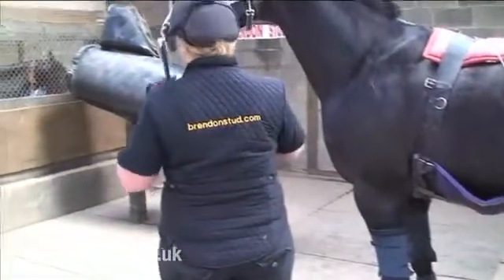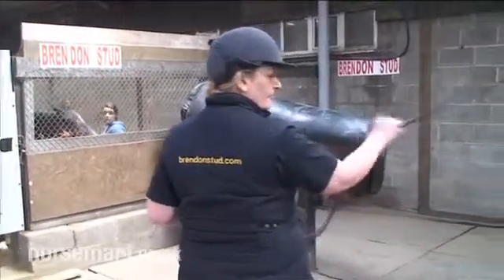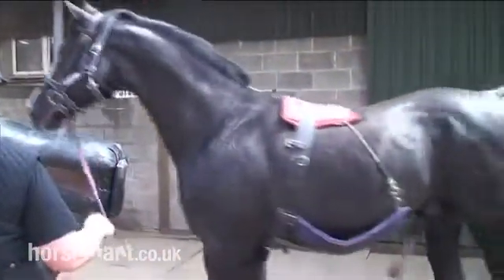It's very important that the stallions are trained to behave really well when the semen is being collected. This is actually quite a dangerous thing to do. The stallion comes and he chats to the teaser mare in front of the phantom.